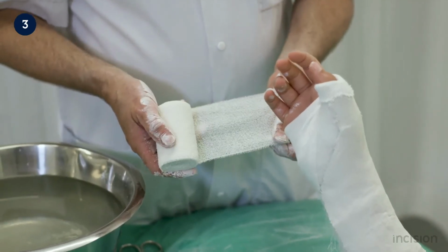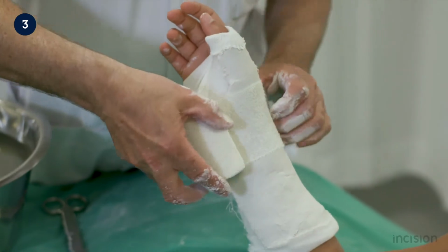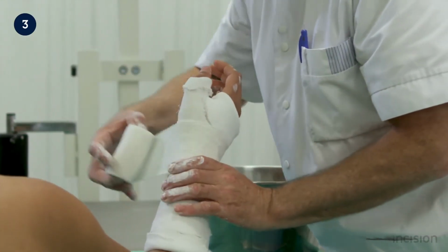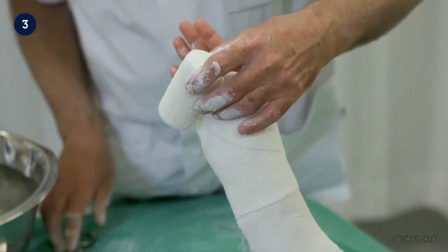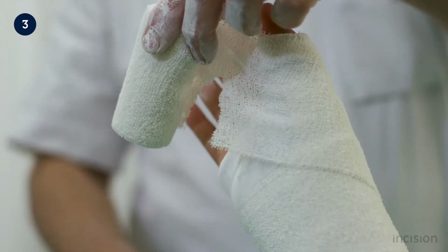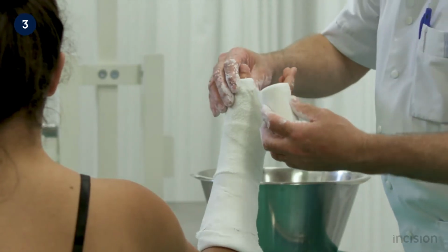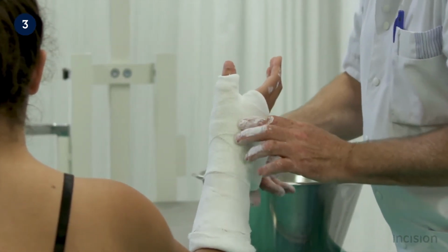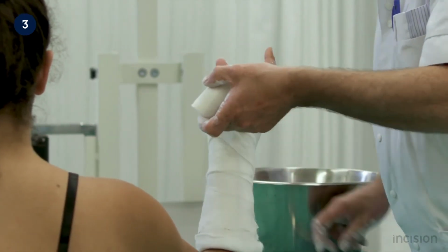An elastic wrap is used to fixate the splint. Again, note that the wrap is applied so that the flat part is in contact with the limb, allowing easy unrolling. After the wrist is encircled twice, the wrap is cut from the proximal side, leaving 2 to 3 centimeters intact. The uncut part is placed in the first web space, and the thumb is completely encircled as shown here. In this way, wrinkling of the elastic wrap is avoided, and the thumb is supported sufficiently.